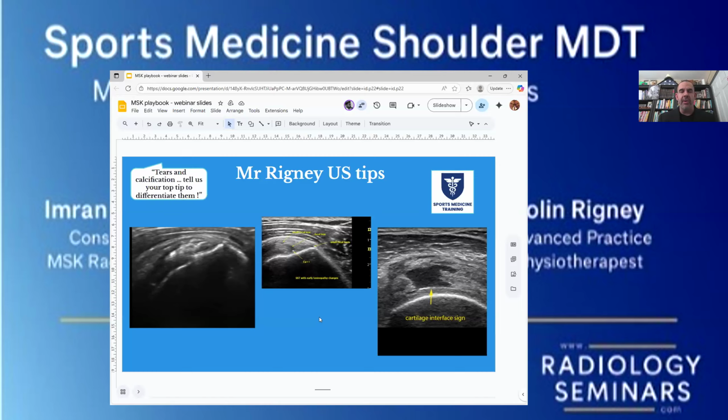But so when we're using our words carefully with patients to define things, okay? Again, focal tears. So you can kind of see it's not out of the ordinary to find multiple things in one image or one particular case. Okay, and it's up to you, the clinician, to decide using the tools available what's the road you're going to go down when it comes to treatment. Okay, now this patient on the left here, let's assume that there's no other intra-articular issues, possibly there might be some incidental findings of AC joint arthropathy and that sort of stuff that Dr.